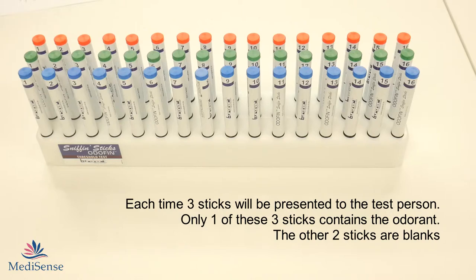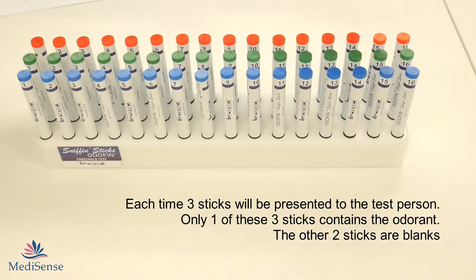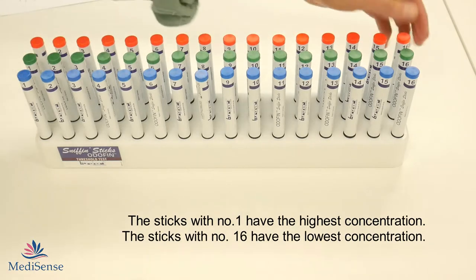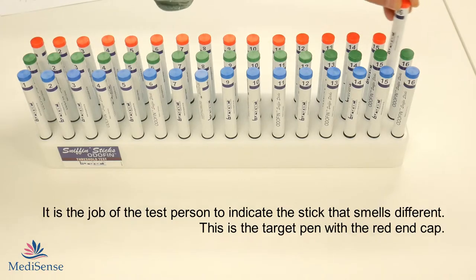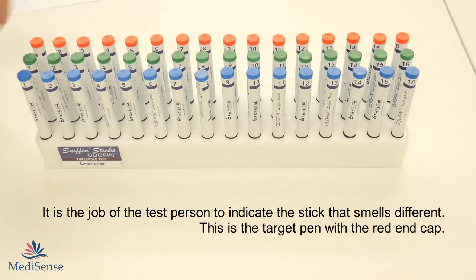With the threshold test, the dilution or concentration works from the lowest concentration to the highest concentration, with 16 being the lowest concentration and the sticks, the triplets with 1 being the highest concentration.